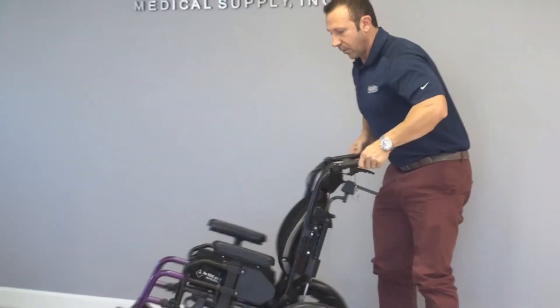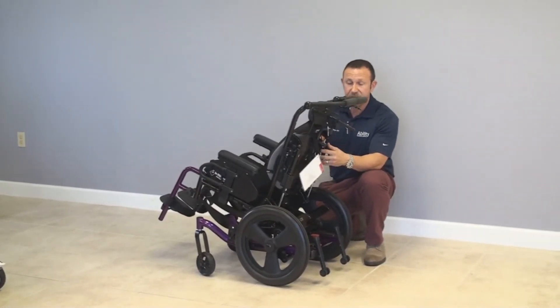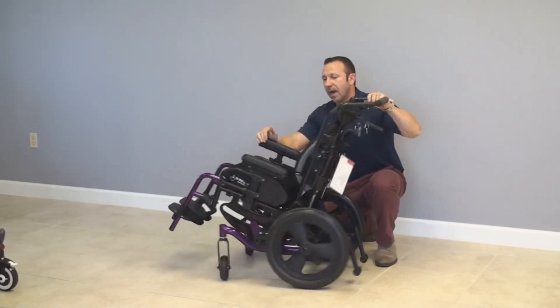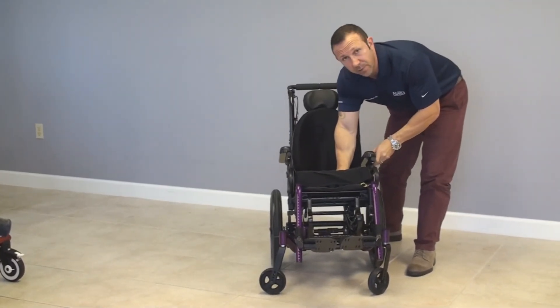We have a nice Roho seating system. This is the Roho Agility back with maximum adjustable hardware. And we have a nice Roho high profile air bladder cushion, which is great for pressure relief.